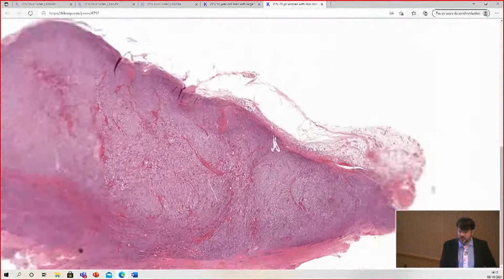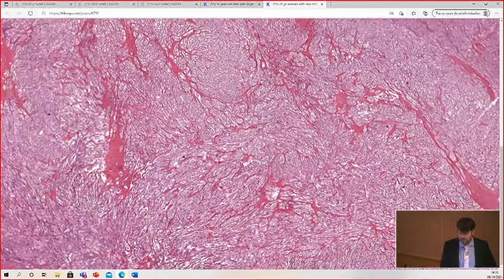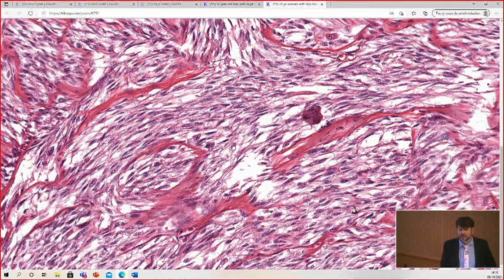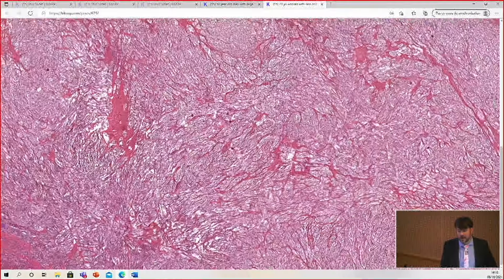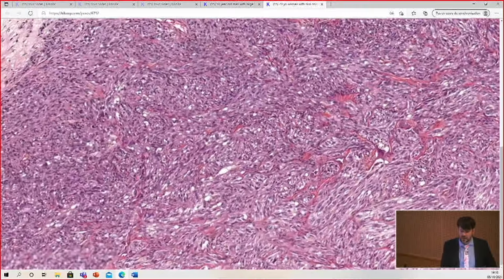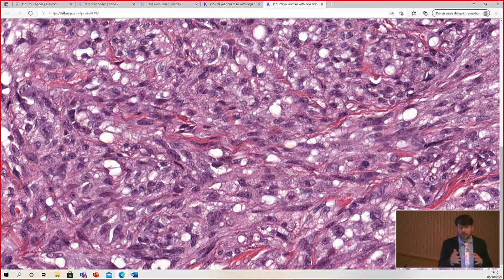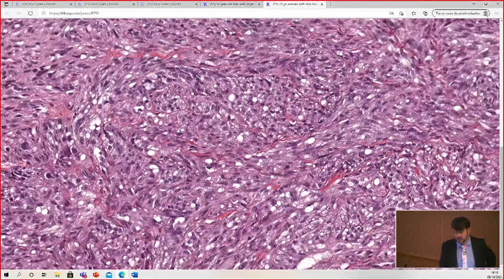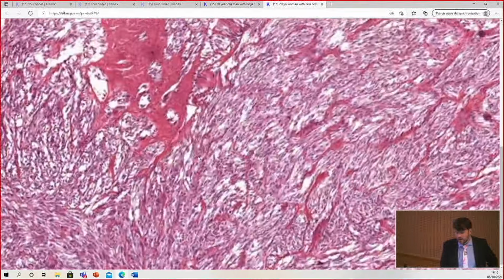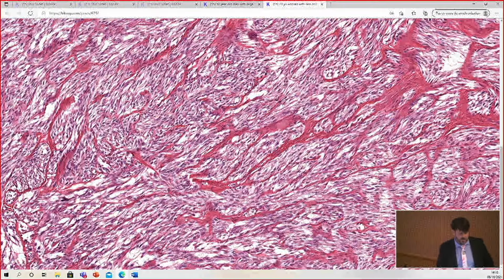So here, this tumor is a nodule, kind of multinodular. It's very pale from low power. As we go closer, you can see a lot of the cells truly have clear cytoplasm. In other areas, the cytoplasm is not truly clear, but kind of pale, like here. Kind of pale gray or pale eosinophilic. So it can run a range as far as how clear the cytoplasm is. I think the most classic areas are down here, where the cells are arranged in these kind of nest and fascicle overlap.